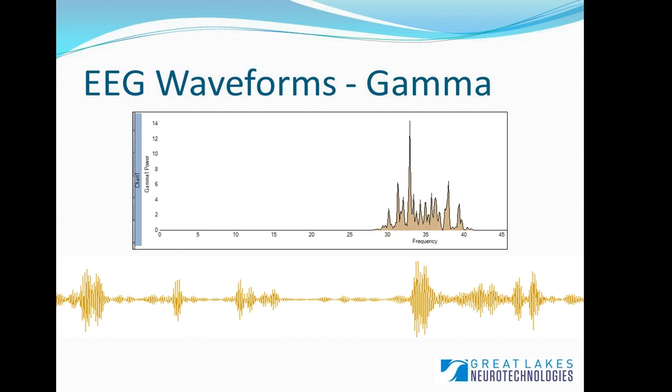So this is just an example of why measuring EEG really is important, because for something like the gamma wave, the more research that's done, the more that can be conclusively stated about what it does or does not relate to.